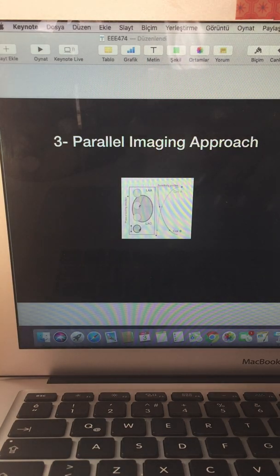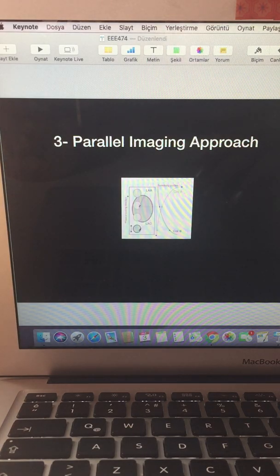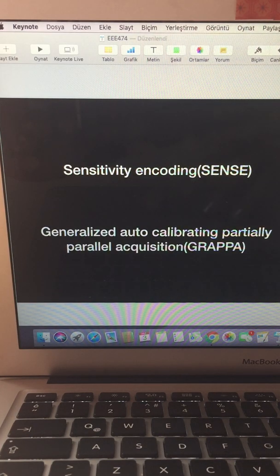The ghost artifact elimination process will be given later. First, make an assumption that Ci is not influenced by an artifact. Then this assumption is used to see whether the signal of the coil fits the previously obtained coil sensitivity or not. If any mismatch happens, then we can say it's an artifact and denote the artifact with LAA. Then LAO is identified. This solution has two parts, SENSE and GRAPPA.